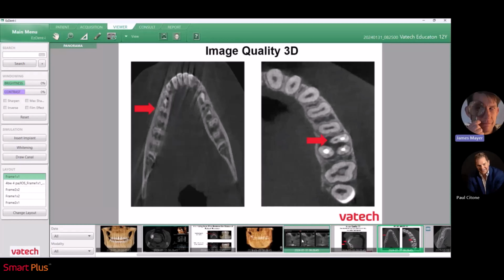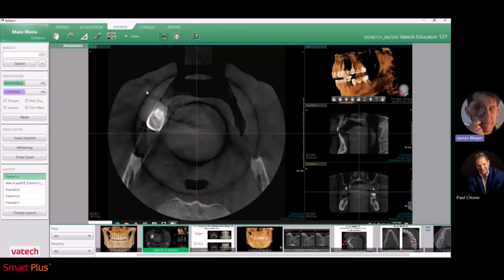Also wanted to touch on something else you may see in the cone beams, and this shouldn't be there. If you do see any circles within the data, you can see here we have one circle, two circles within the axial cut, and some long, dark vertical lines in the other. This is where the device needs a beam alignment or some internal adjustments. So if by chance you do see that, that is something else that we would need to have our service team log in and adjust.